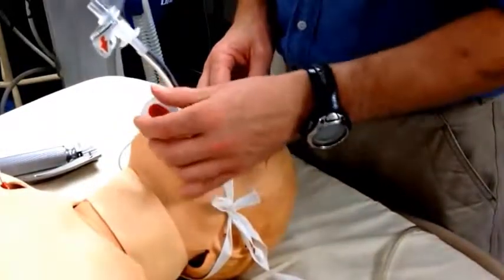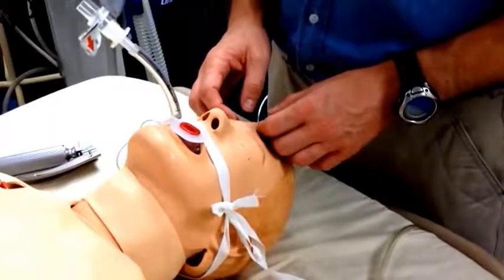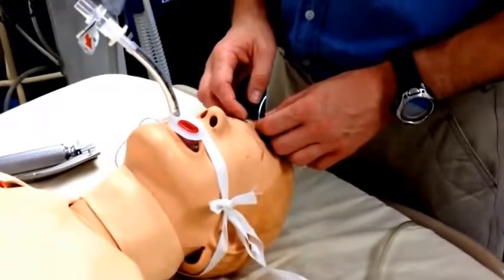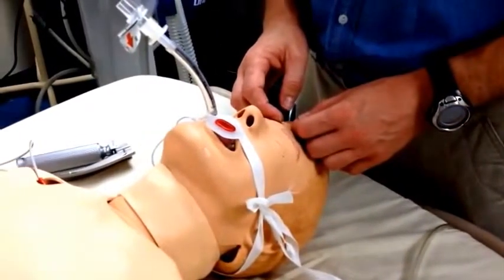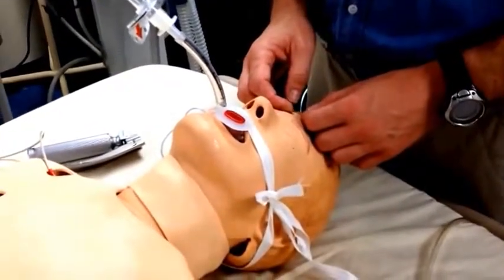Insert the oropharyngeal airway as per usual, and make sure that the oropharyngeal airway is removed and changed for a bite block as soon as possible, as prolonged insertion of an oropharyngeal airway in a ventilated patient is associated with tissue destruction and ventilator-associated pneumonia. And that's it, the mechanics of rapid sequence intubation.